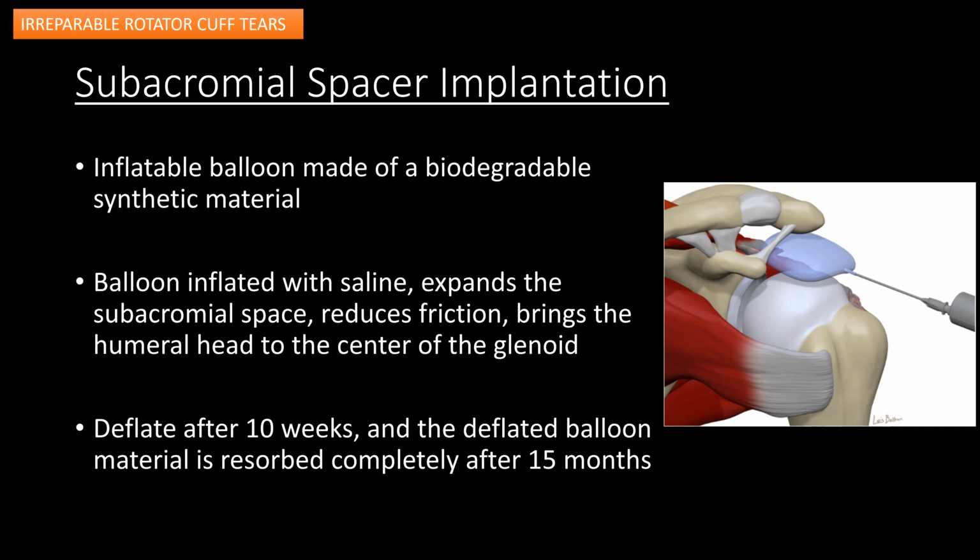They introduce the balloon via an arthroscopy portal into the subacromial space, and then inflate the balloon inside the body. Interestingly, the balloon is expected to deflate after 10 weeks, and the deflated balloon material is resorbed completely after 15 months. So I'm not sure about the long-term effect of this surgery, but there are studies which have shown short-term pain relief and improved function after surgery.